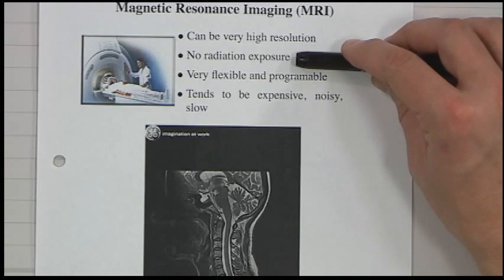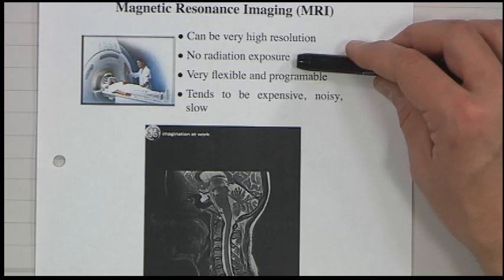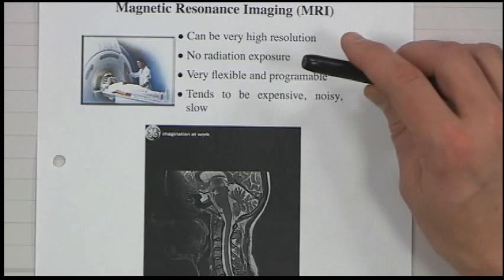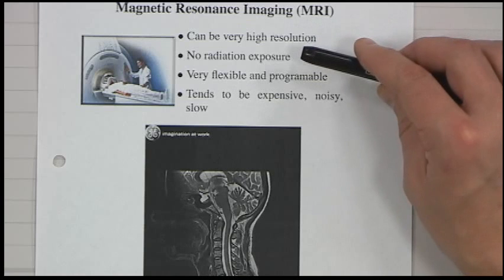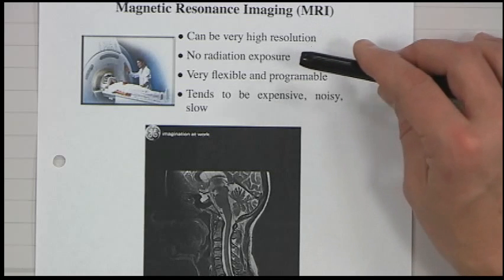There is exposure to RF energy, which can cause eddy currents in your body that can cause unintended stimulation of your central or peripheral nervous system. So basically, if they crank it up too high, your arms might start flopping around, which isn't exactly fun. I've never actually had it happen to me. I don't think it does any permanent damage, but they definitely have to avoid that. So they have to measure those things carefully and not have gradients of the coils too high. So there are some issues. It's not perfect, but you don't have ionizing radiation that causes cancer.